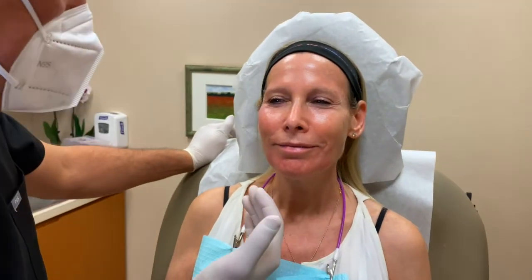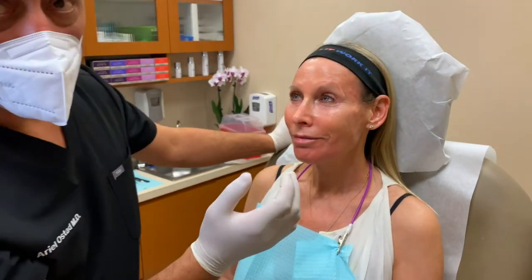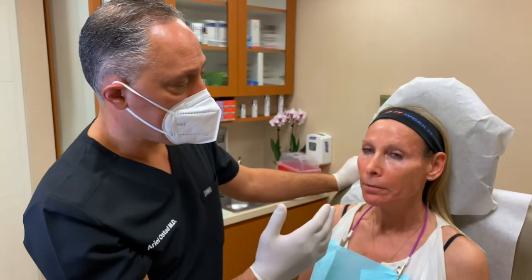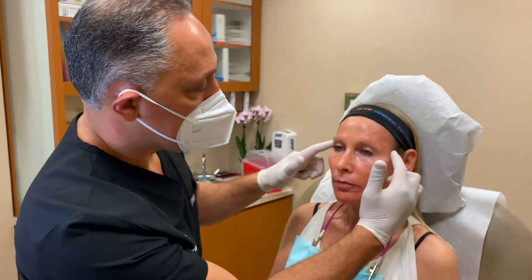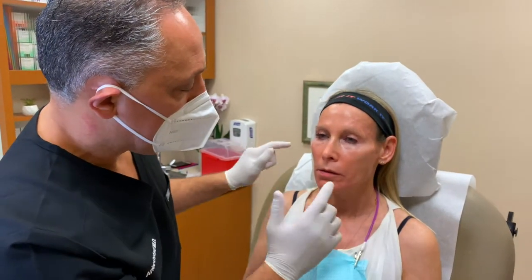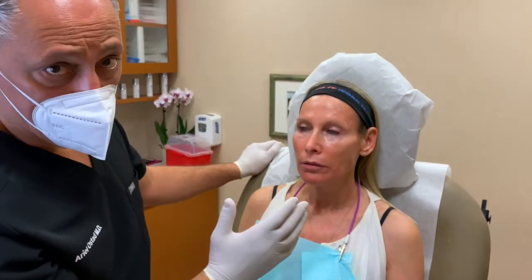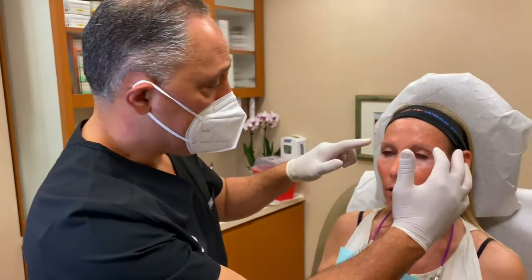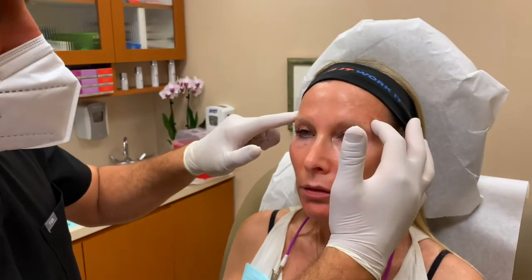Go ahead and smile. You can see she looks great smiling. One of the things that we did not address, which I will do, I'm going to ask her to come back in 3 weeks, Adrian. And what I love to do is we can address it, and I'm putting more in here for you. I would love to do your lips to create balance. It's about really fitting the proper picture. I would love to even help her with her eyebrows, but we can even do a little bit of filler in here.